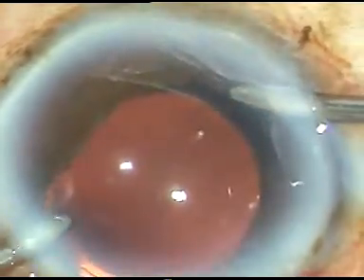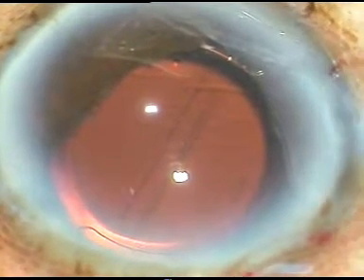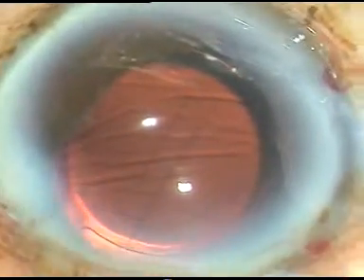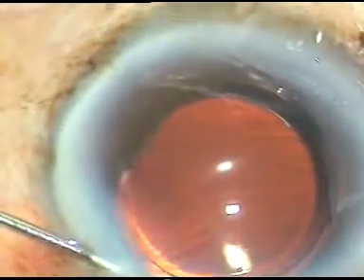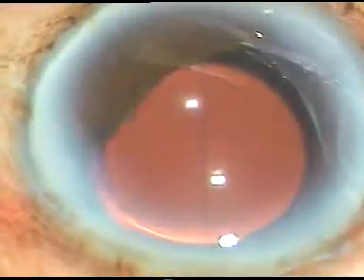The viscoelastic substance has been nicely removed. Now I hydrate the side ports with BSS — balanced salt solution — and a 27-gauge cannula. Once the side ports are hydrated, this is the final wash. Hope this video will help you and inspire you to do surgery in a more neat and clean way. Thank you for your attention.